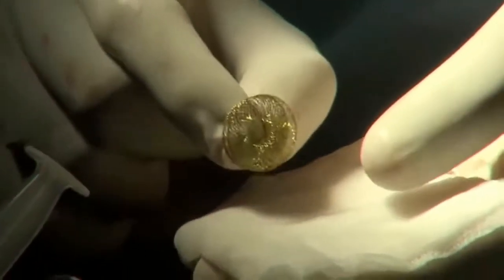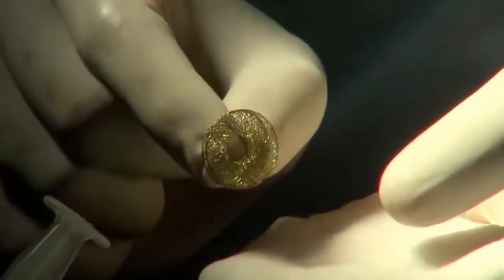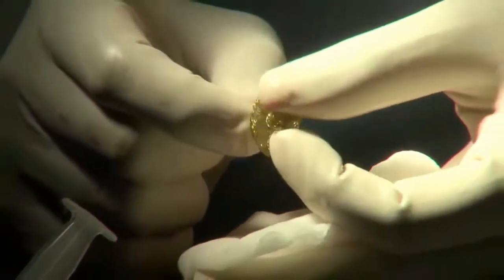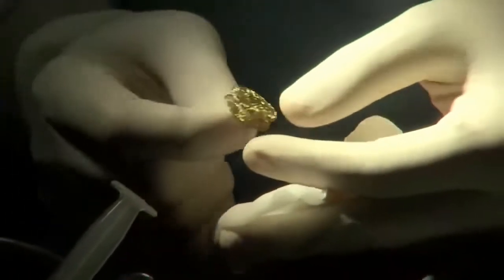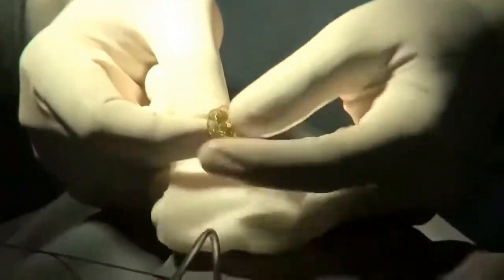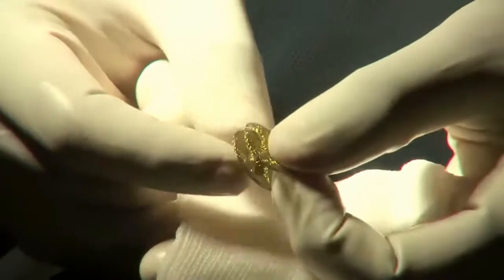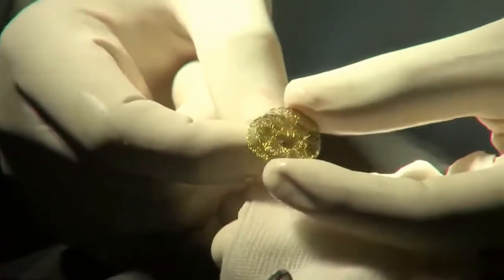And still with the 4 millimeter fenestration, I think you still have enough hole to allow decompression of the Fontan pathway. And a 6 millimeter may not, let's say, shrink this hole sufficiently. What do you think? Yeah, I think so. I was thinking. Well, I must say, the problem about a 4 millimeter is if it closes off acutely, then we will be having a problem of acutely failing Fontan.